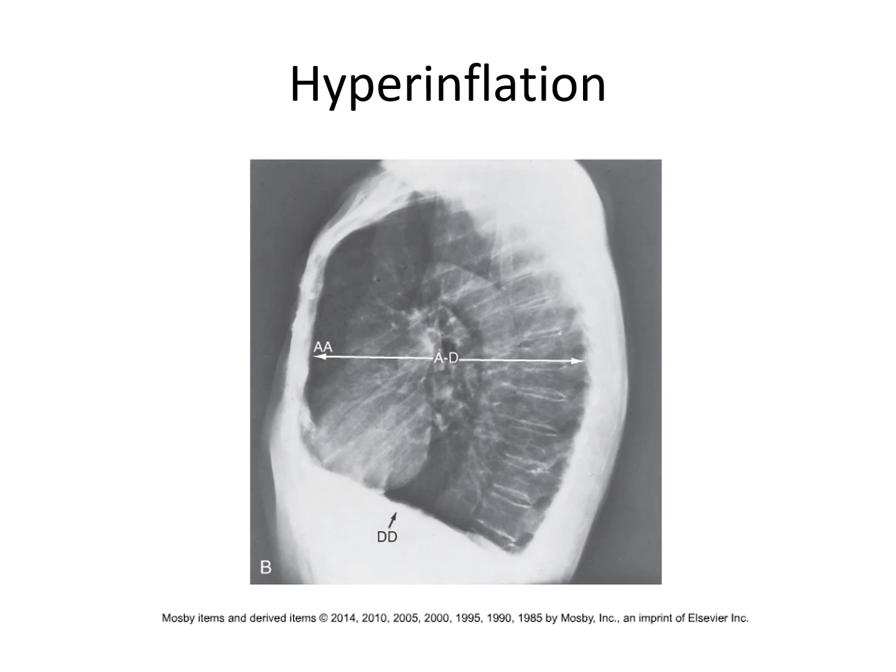That retrosternal airspace is kind of like here by the double A. There's kind of a big space of air between here and the sternum itself. So the larger it is, the more severe the COPD or the emphysema is.